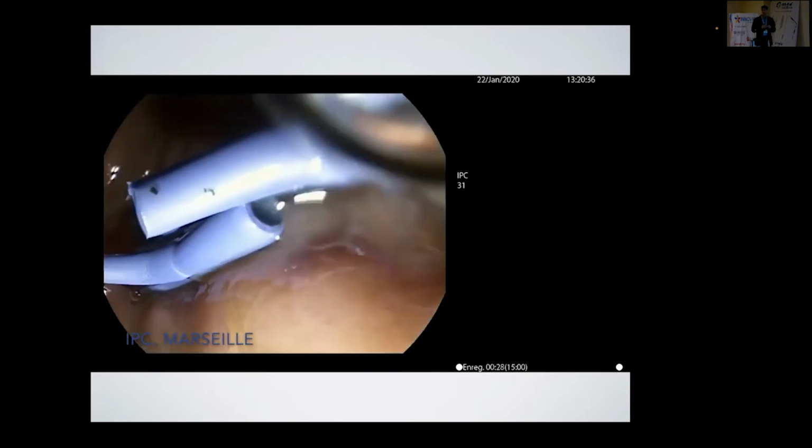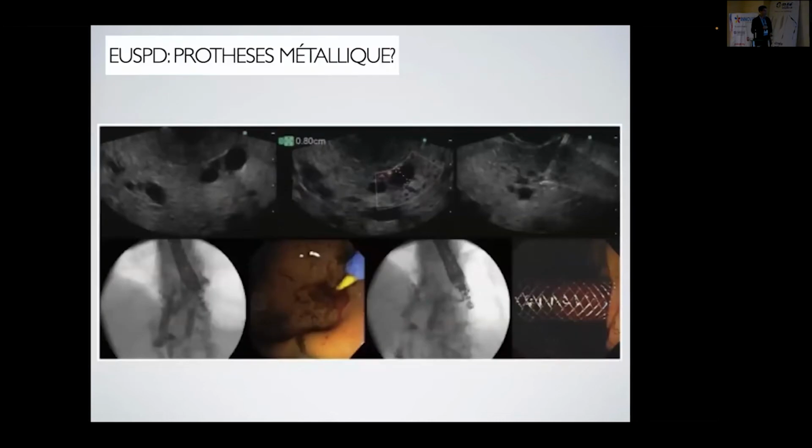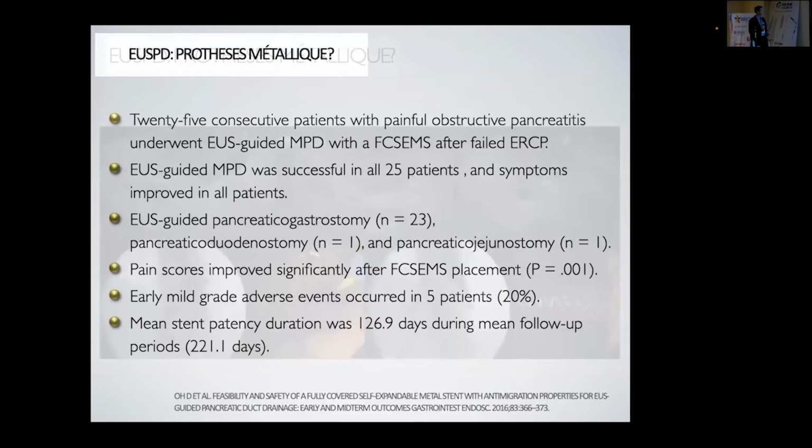2 stents to block each other and to create a permanent fistula and the leakage of pancreatic juice in the stomach. An interesting paper about pancreaticogastrostomy is a paper from O et al. It's a pancreaticostomy using metallic stent. Sorry, it's in French. I'm sorry, I didn't see.